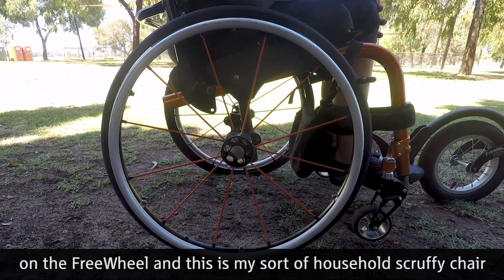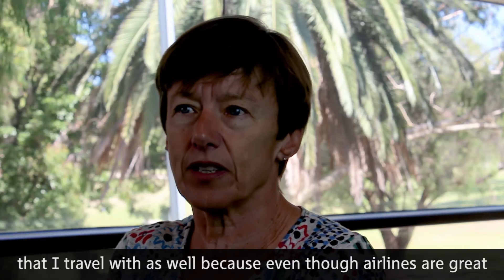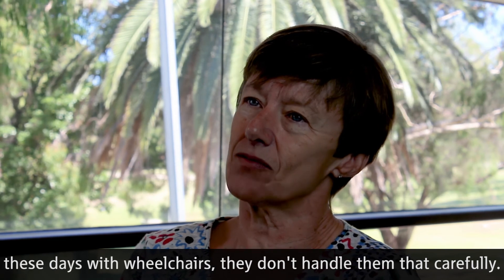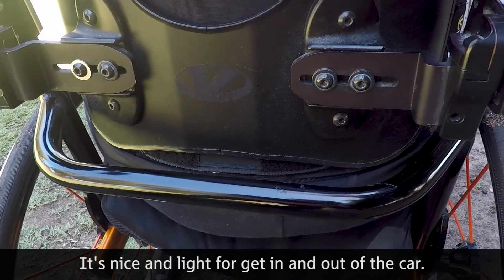This is my household scruffy chair that I also travel with, because even though airlines are great these days with wheelchairs, they don't handle them that carefully. It's nice and light for getting in and out of the car.